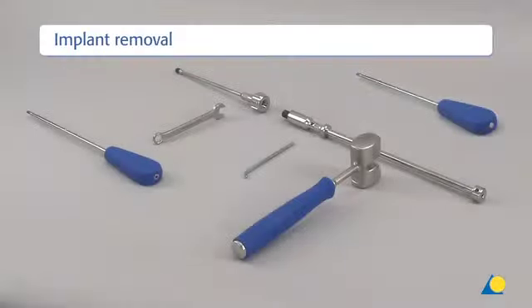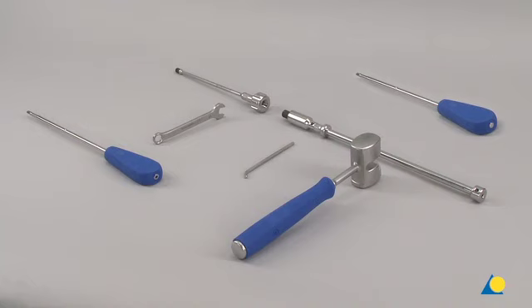Clinically, implant removal is an optional procedure. The instruments needed include the screwdriver, star drive T40 with spherical head, cannulated, length 330 mm, the extraction screw for tibial and femoral nails, the combination wrench 11 mm diameter, the hammer guide, the pin wrench 4.5 mm diameter, the screwdriver star drive T25 self-holding, length 330 mm, and the combined hammer.